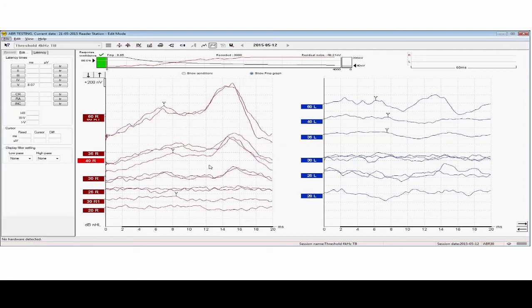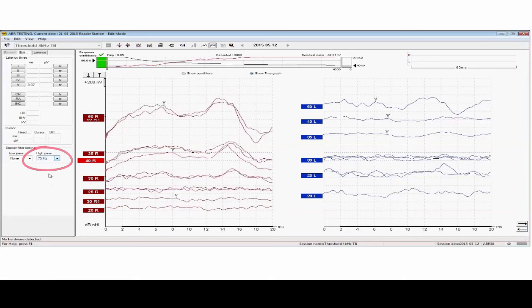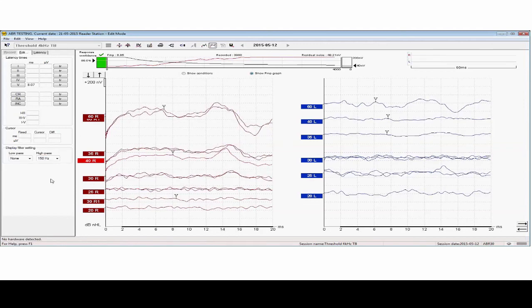A technical way of getting the PAM a little bit out is by changing the high pass filter. I think let's try it here. If I change the high pass filter, you remove slow movements from the curve, and that reduces the PAM, so it takes less space in the curve, but it also removes part of your useful ABR energy, so that's not the ideal way of getting rid of it. But if the patient cannot get rid of it and you think it's important to get a very clear, nice picture, then you can play with the high pass filter settings.